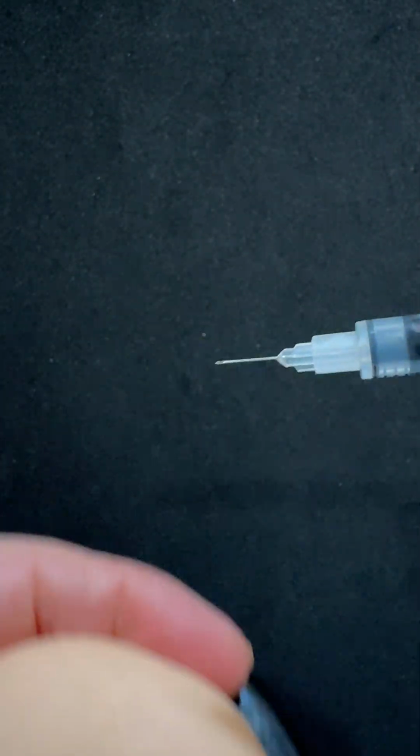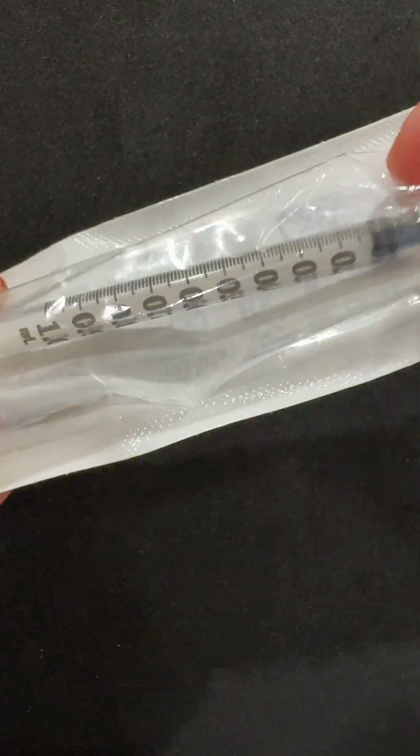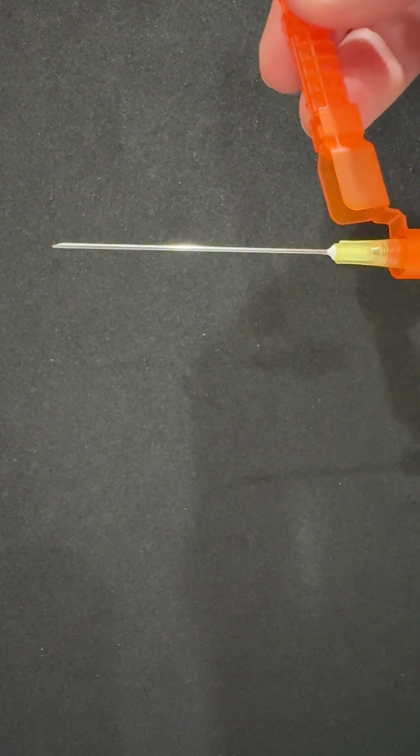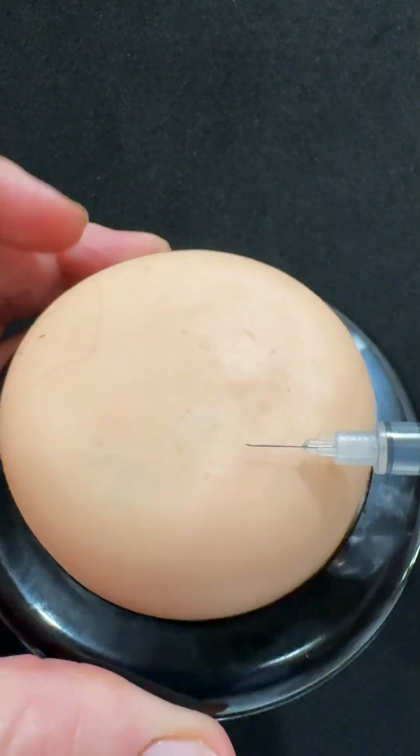And I always want to make sure when I am selecting, a lot of our syringes come with just the syringe but no needle attached. We're the ones that have to go and select it. So don't go and pull a needle like this if you're going to give somebody something subcutaneous. That is way too long. That's like 1.5 inches. So always remember, the higher the gauge, the thinner the needle. And we want a very, very, very short needle for our subcutaneous injections.